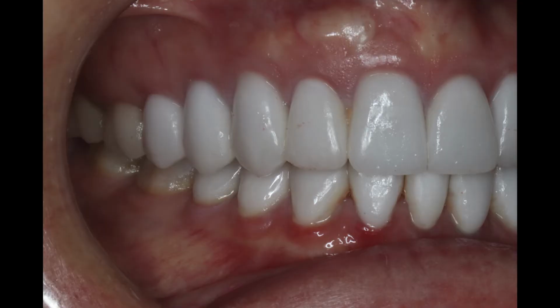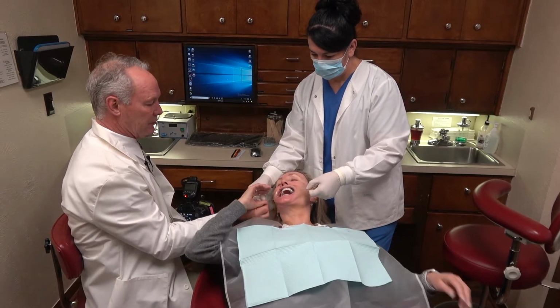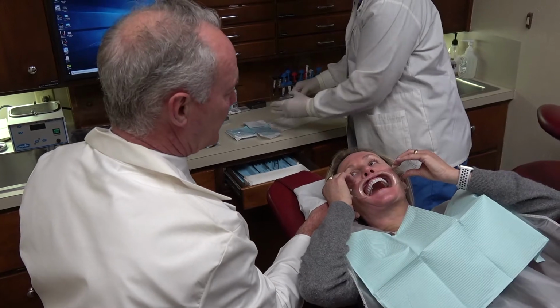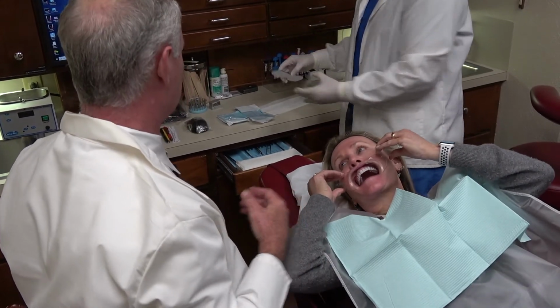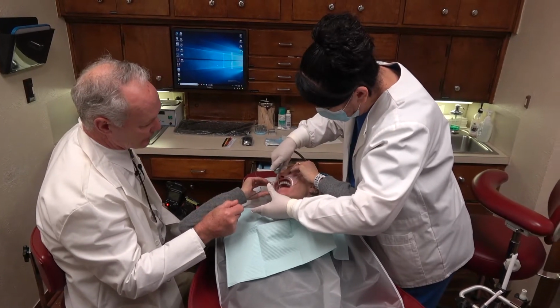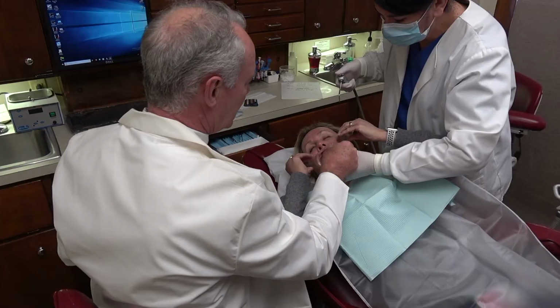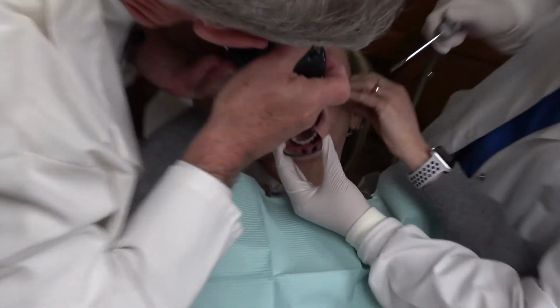Okay. Now Sharon, would you reach up here and hold these, please? I want you to hold these retractors up and out as far as you can, kind of between your eyes and your ears. And turn my way, please. Okay, the small. And blow a little air on this occlusal surface, please. You want to blow some air on the occlusal surfaces of the teeth. Open real wide. Got some nice dental work done there.